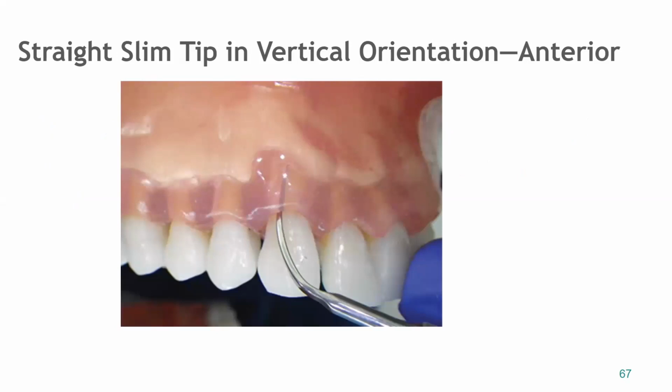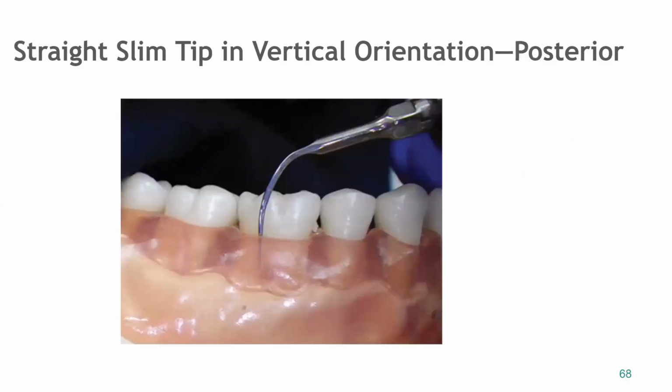So this is just showing our adaptation here. Again, all the examples they're showing right now are piezo tips, but I'll show you guys these with our Cavitron tips too, okay? A straight slim tip in the vertical orientation on a posterior area.